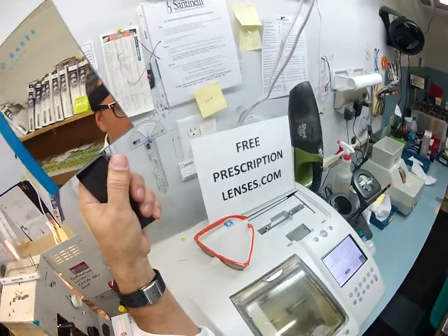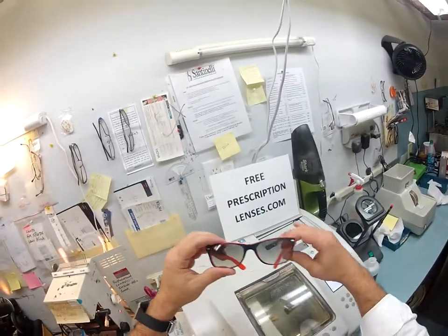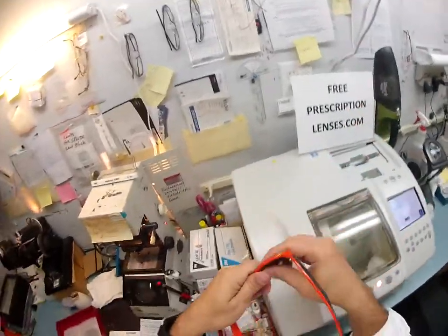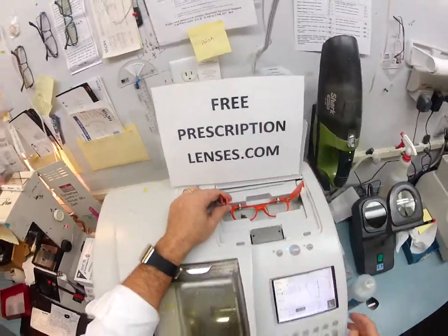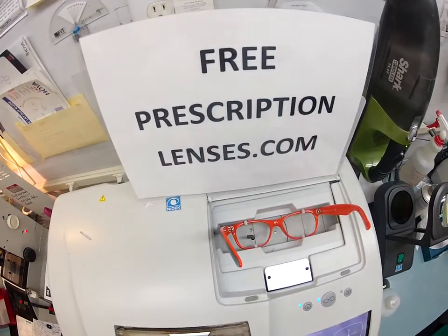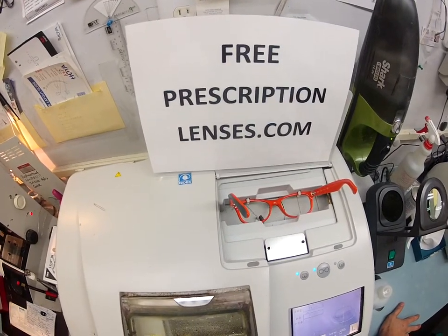Ryan Matthew here with freeprescriptionlenses.com. I'm going to show you how I cut your second pair of prescription glasses. You got the Ray-Ban blue rubber before — now we're going to turn these into your sunglasses. They're color 789, the rarest of all Ray-Ban colors. Most people don't even know this exists. I'm going to take out the original demo lenses, put it in my Italian Santinelli LE 1000 patternless edger, and it's going to trace both lenses.